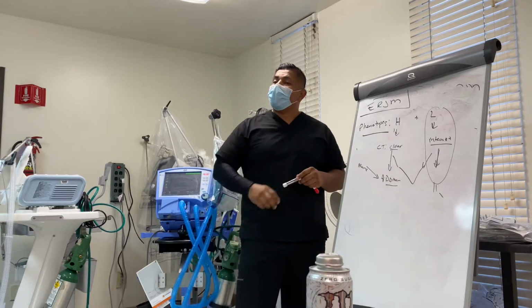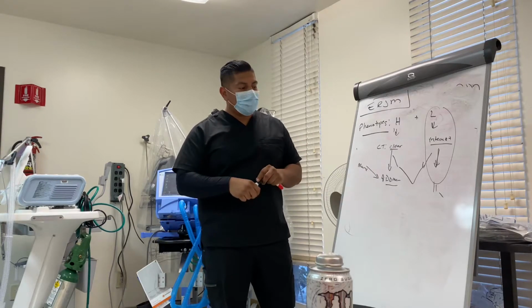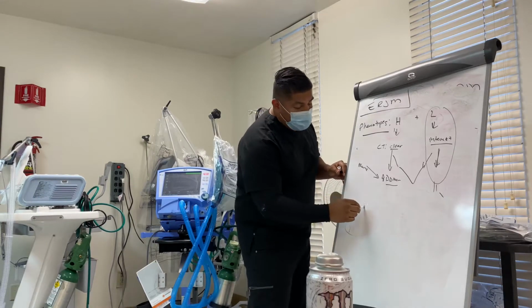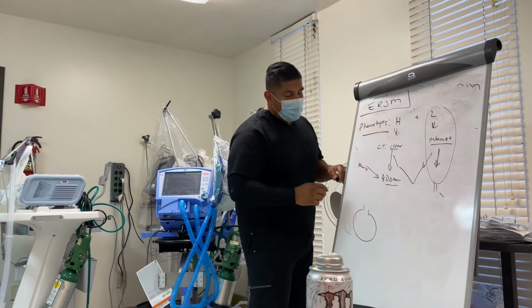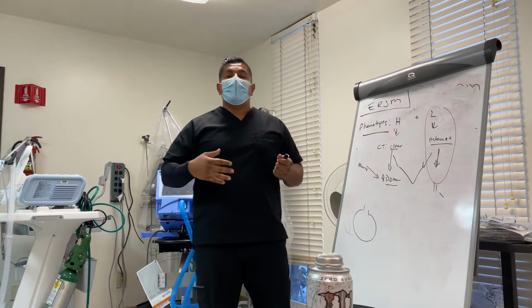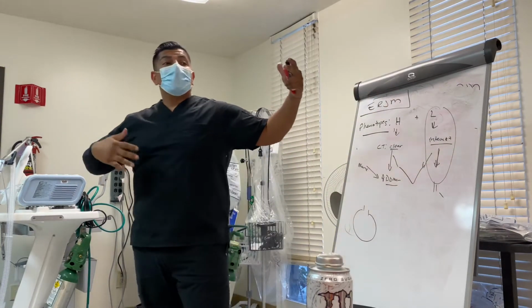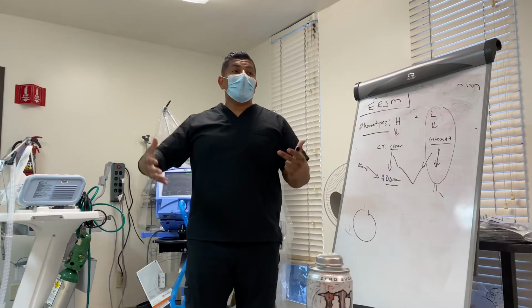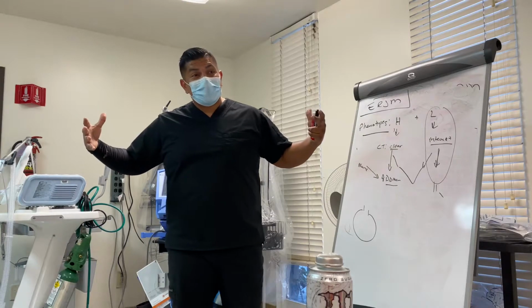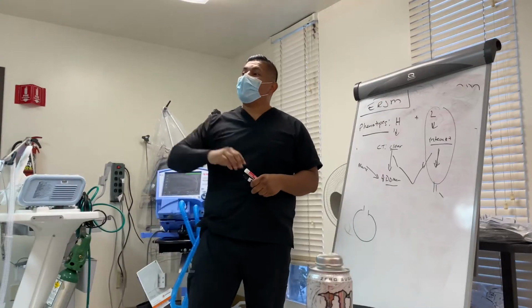Do you remember how we said that when we're forced to go into pressure control, we have to look for oxygenation? Before 2000, our old school thought was 8 to 10 mLs per kilo. High tidal volumes, low respiratory rate. But the study showed that a lot of these patients were going into ARDS. Too much shearing. What was the culprit? Old school volume AC. Now they like low tidal, because there is less shearing.